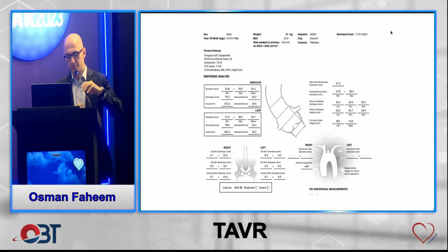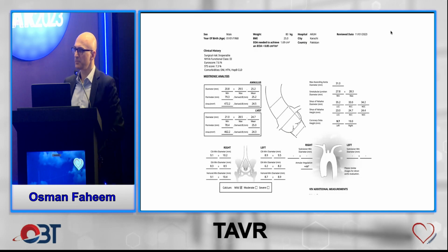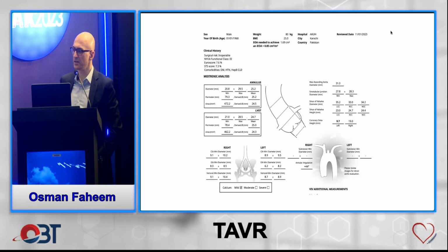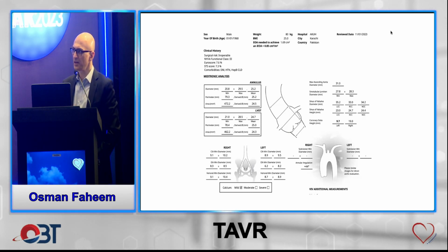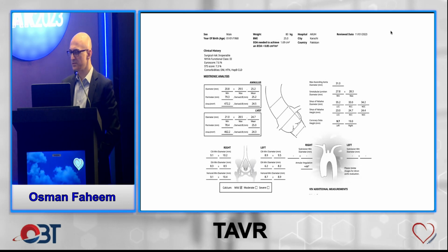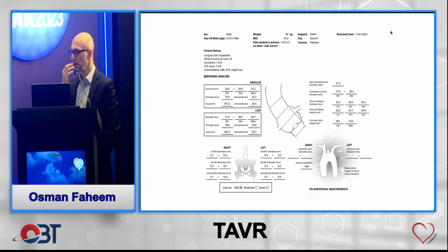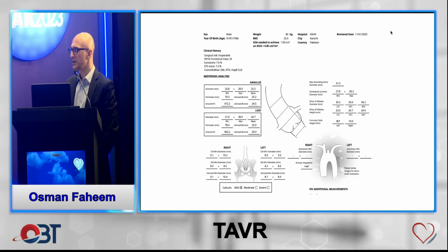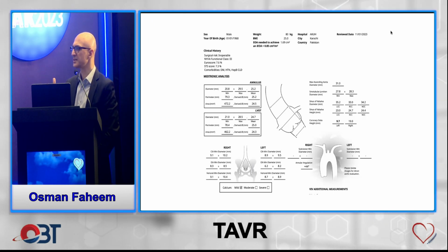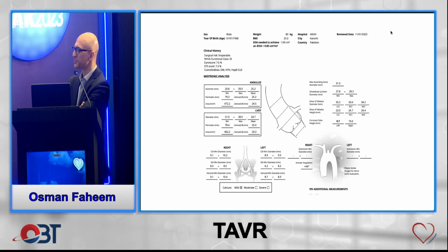All right. So moving on, let's talk a little bit about pre-procedure planning. Just like any other procedure, attention to detail and looking at all the patient factors yourself really matters. This is the report that you will get from the company, whether that's Medtronic, Edwards, or Boston Scientific. So, Asaad, what do you look at? I think all of us look at the CT scan ourselves and do all of our measurements, but this is the report you get. So what do you look for in the report?